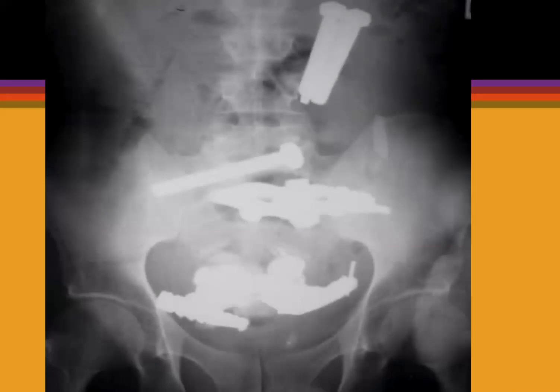So I hope you found this very quick overview of the abdominal X-ray useful. In the last few years, we're looking at abdominal X-rays less and less. They do have a role in obstruction. They do have a role in abdominal perforation, foreign bodies. But CT is superseding them, because CT is much quicker to get nowadays. It will give you a definitive diagnosis.